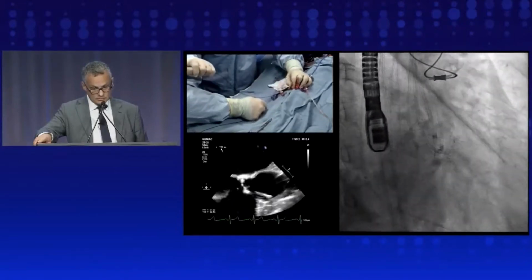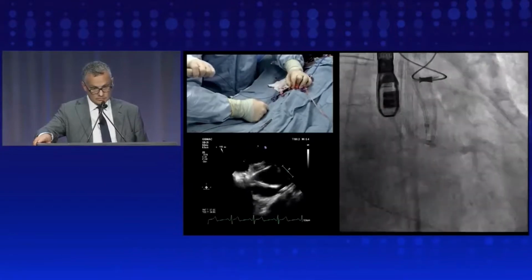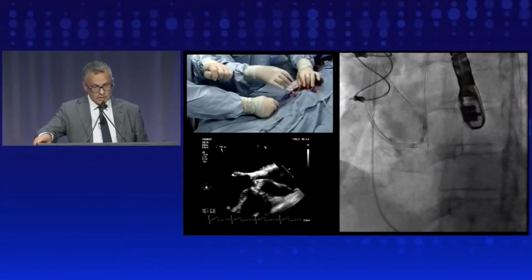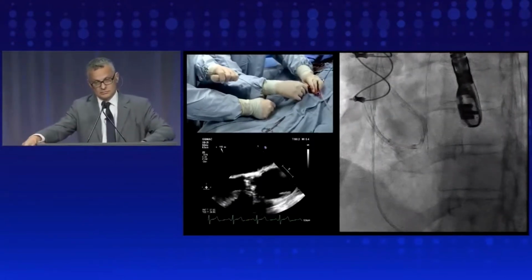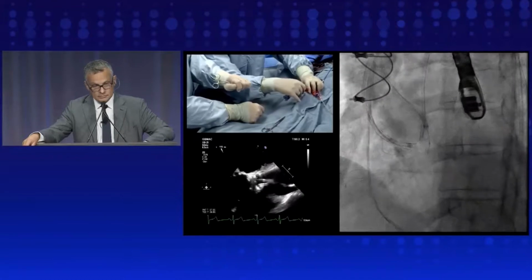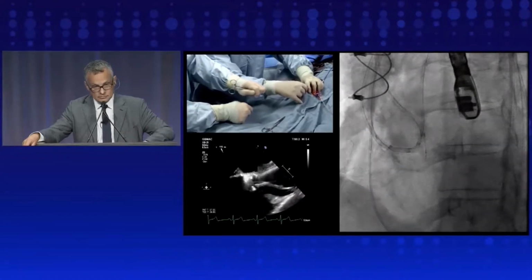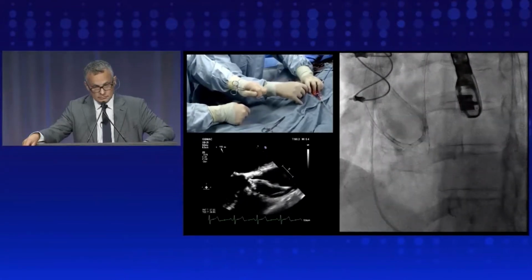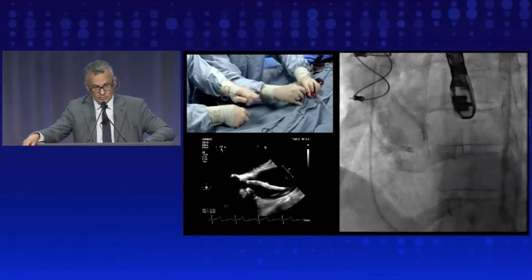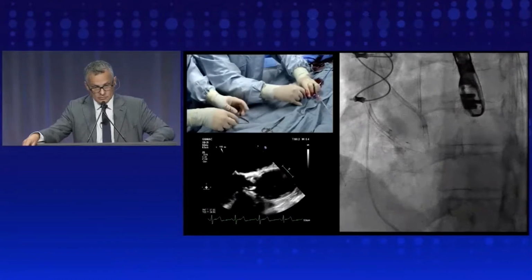Okay, not better. Got that other funny wire in there, so the two catheters are kissing. I'll just pull a bit the 8 French. You can see shortly the new kink coming into place. You'll see it coming there from left to right, and it's just there probably now. You guys feel it? Yep. Perfect. There it is.